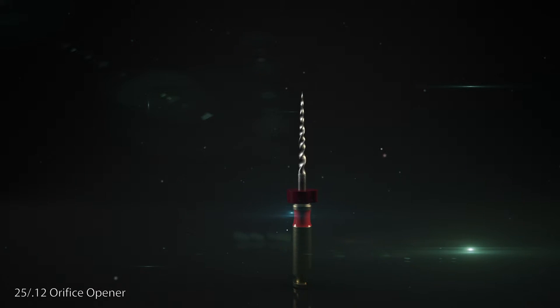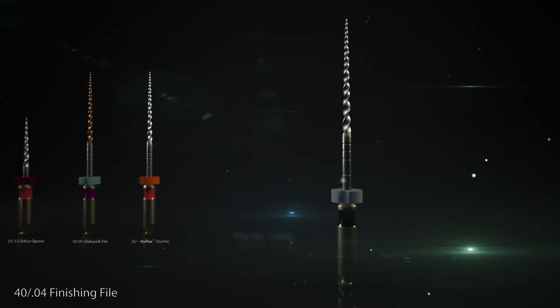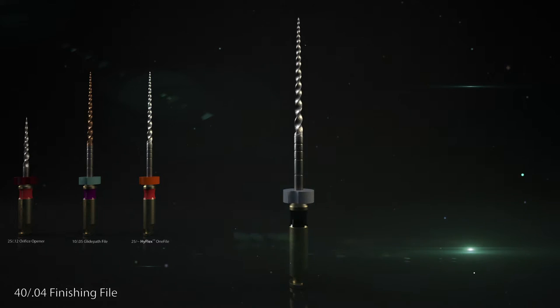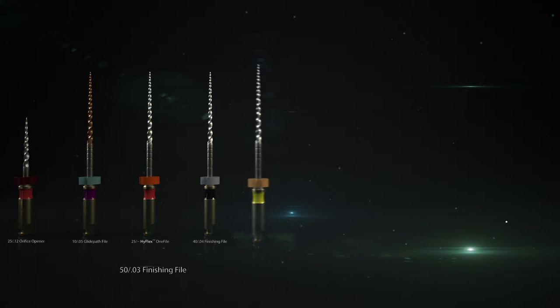Thanks to the modular structure of the nitinol system, all the files in the HyFlex CM and EDM series can be individually combined. They remain serviceable at all times as long as they resume their original shape after a heat treatment. Matching the versatile HyFlex files, Coltène also offers suitable gutta-percha tips to ensure optimal obturation.